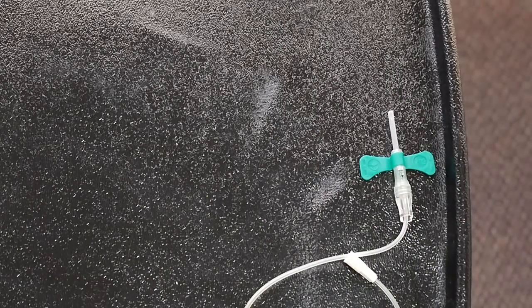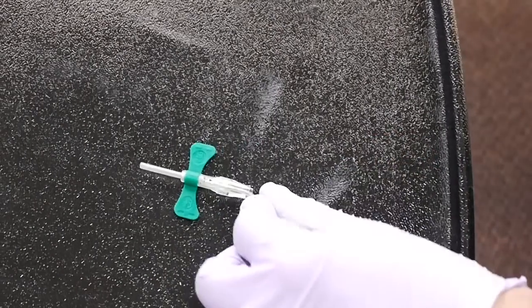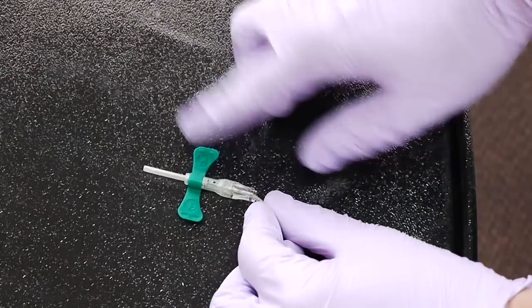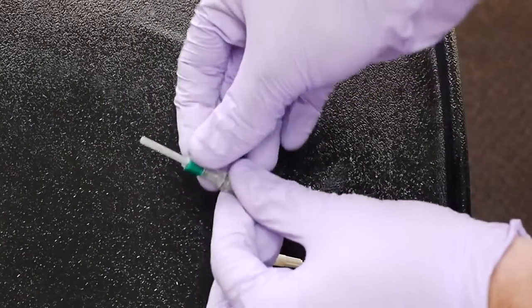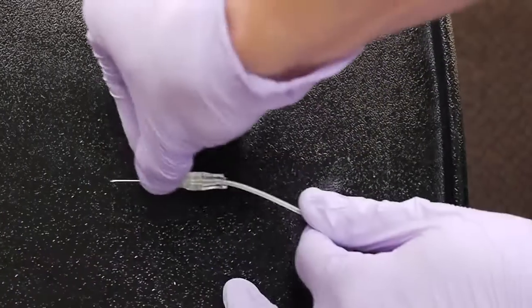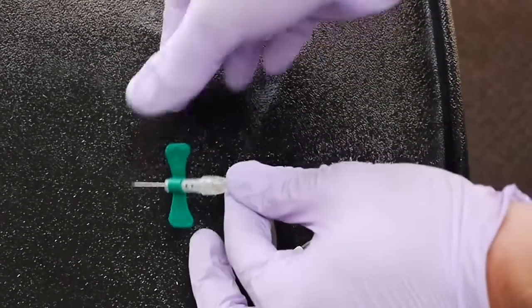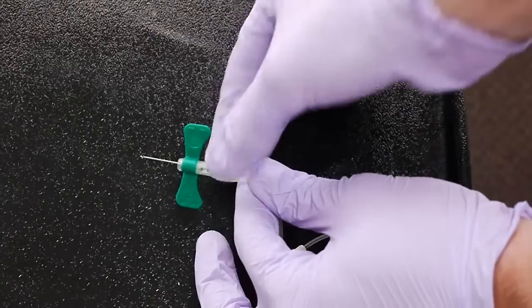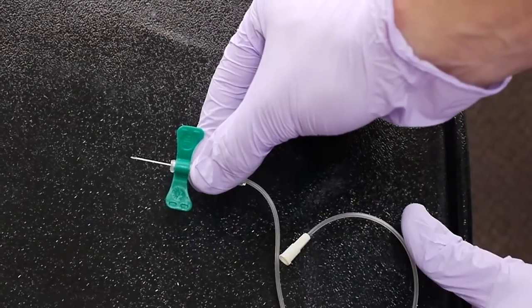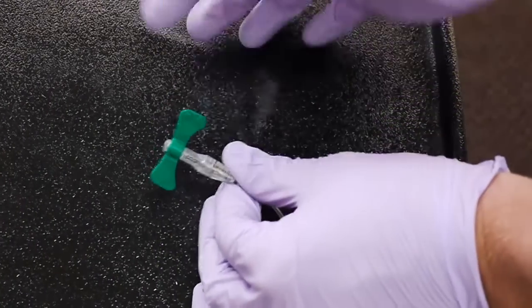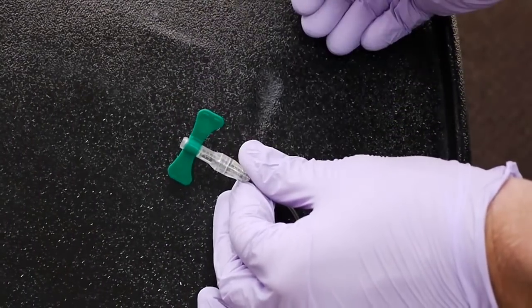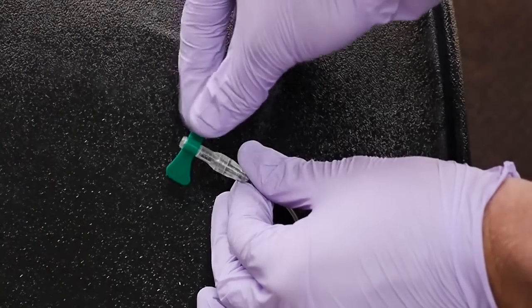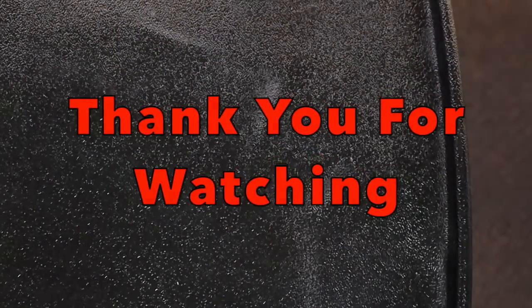And the last device we have is the other type of butterfly that we'll be using. This one, after the needle has been exposed and you are finished with the draw, you can simply push the button on the top of the butterfly. And it will retract the needle into the barrel. And it is now safe. And you can dispose of it into the sharps container.